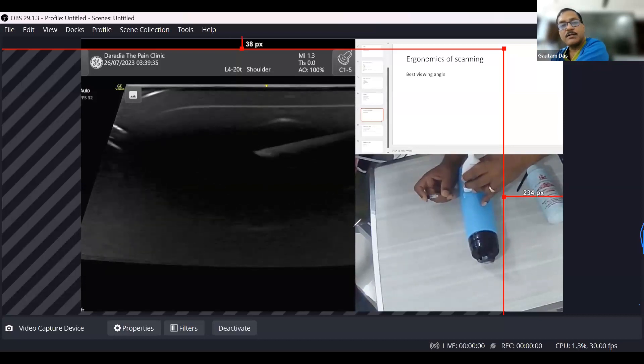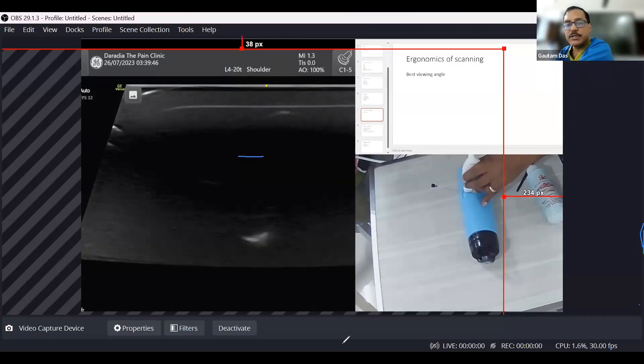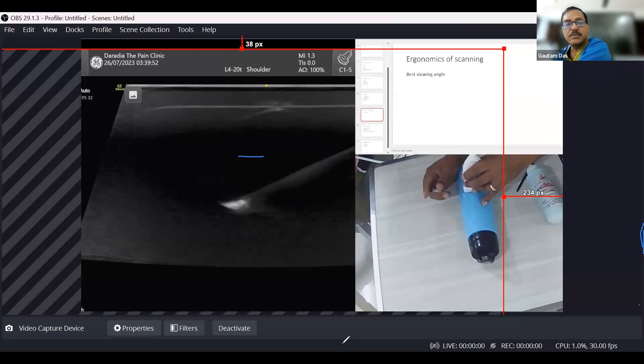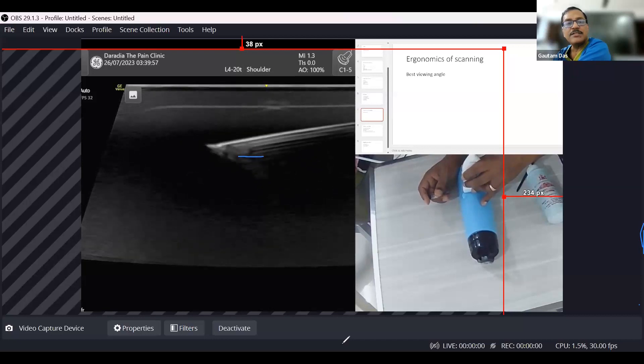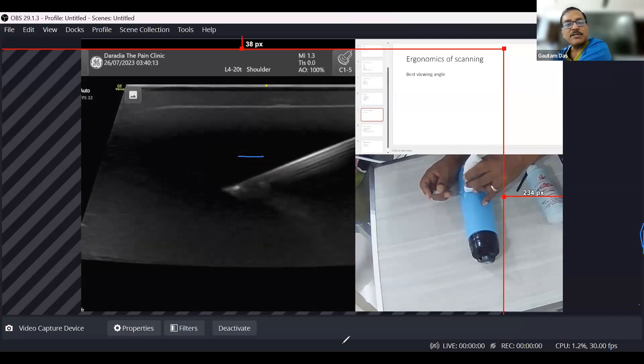Look at the needle and what is happening. When I am decreasing the angle, you can see the reverberation as well. When it comes almost horizontal it looks best. But as I am increasing the angle, look at the visibility — at almost 30 degrees, the needle starts to vanish.